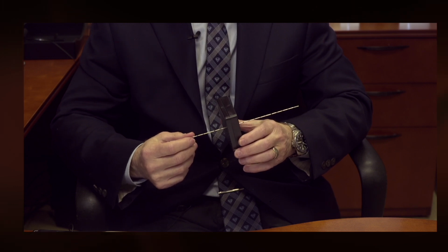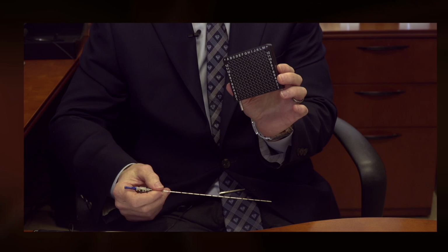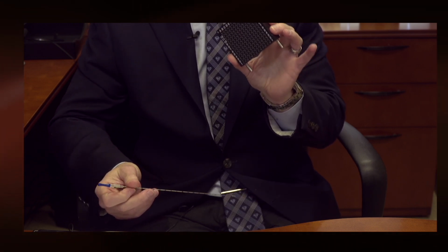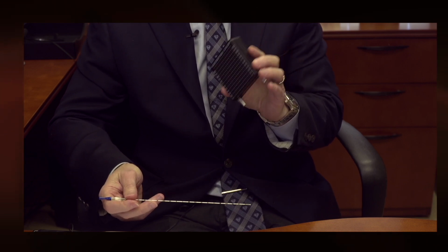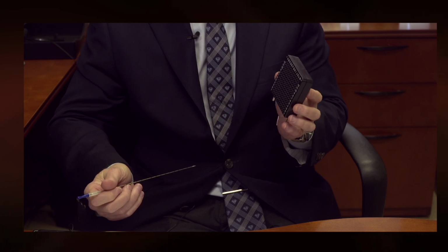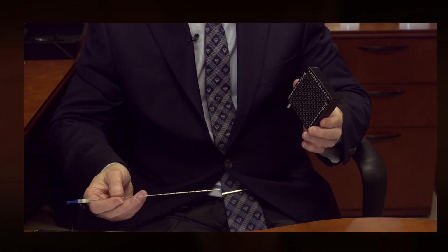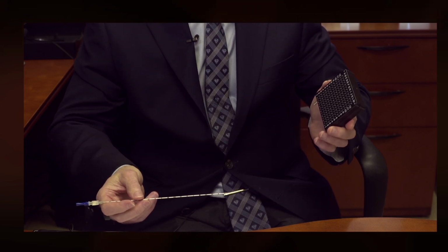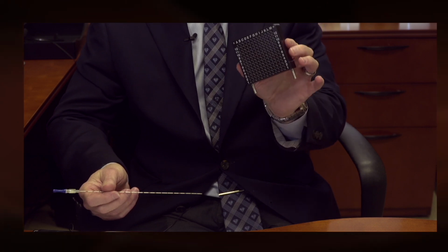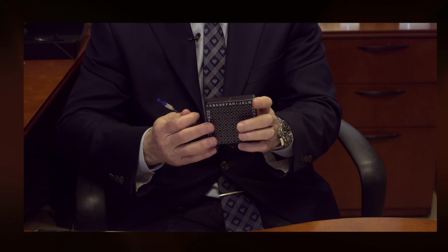When I do a seed implant or even a biopsy, we use what's called template guidance. This is an example of a template. It's got letters and numbers on it. And this correlates to a grid that we see in our ultrasound machine and also on our computer screen in the pre-plan. Don't forget, in the pre-plan, whether it's a seed implant pre-plan or a biopsy pre-plan, I've already done a virtual seed implant or a virtual biopsy on you on the computer screen. So in the operating room, we're just emulating that, but we're actually using this template up against your skin in the perineum, as I described earlier, between the scrotum and the rectum.